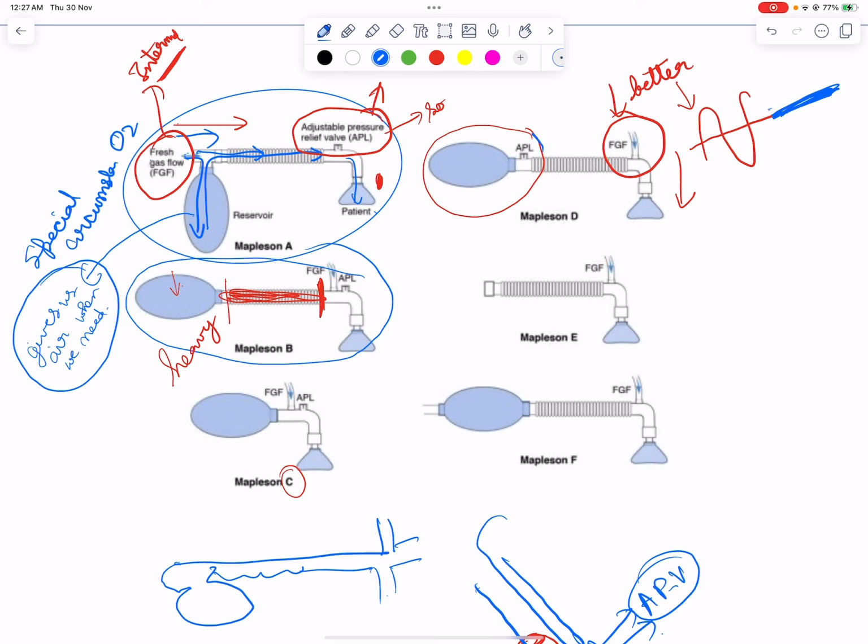So then the standby system that we have can be placed distally because there is not much use of it, and also for cleanliness purposes, it is easier to clean it from here and let all the pathways, that is oxygen supply, be working here. So in Mapleson D circuit, you have to remember that all the other accessory equipment is at the distal end.